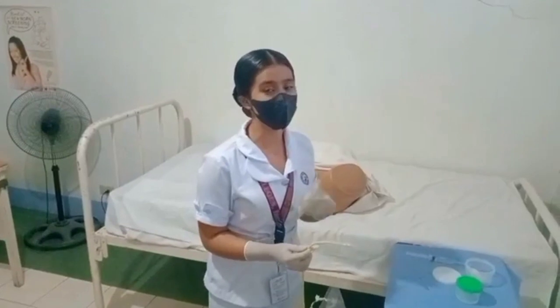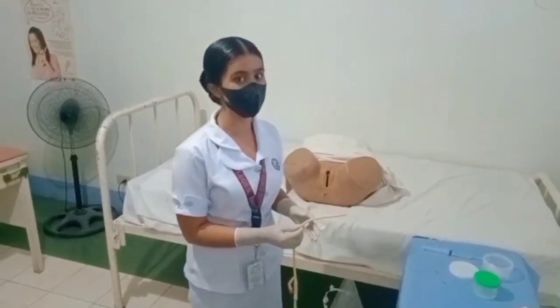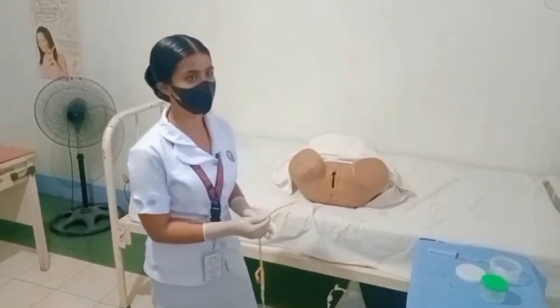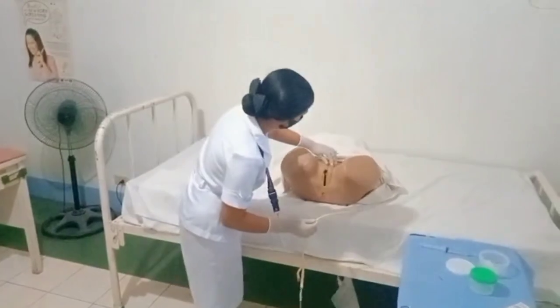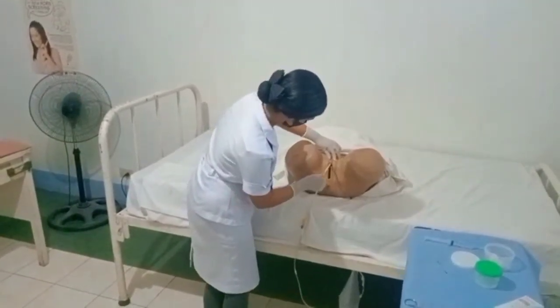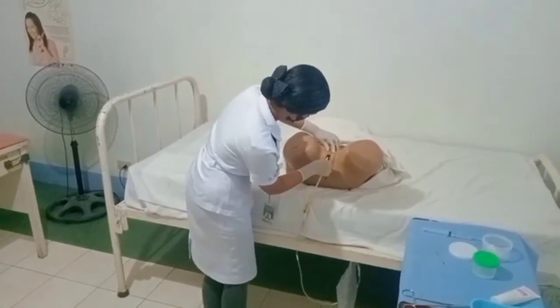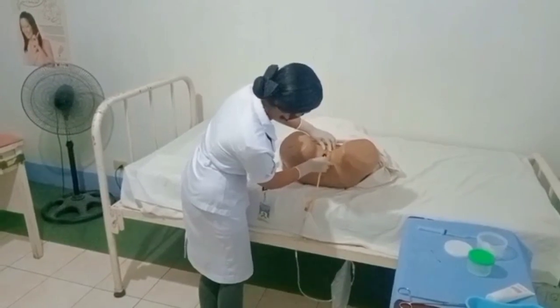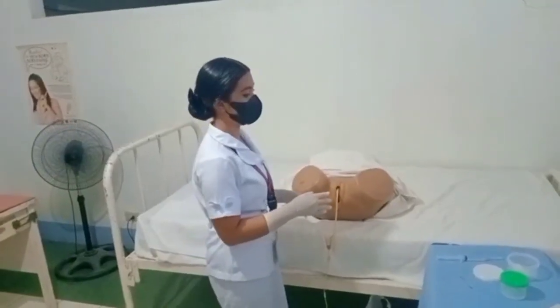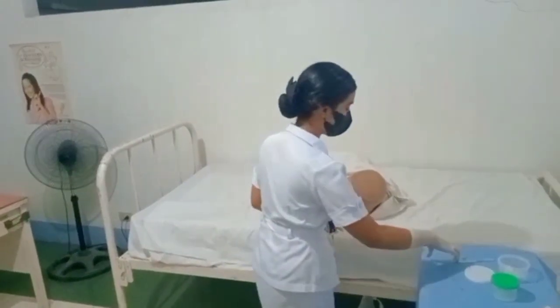And next, I am going to insert the catheter gently in a rotating motion 2 to 3 inches because the patient is female. Now, can you take a deep breath when I insert the catheter? And then I am going to inflate the retention balloon with the sterile water.